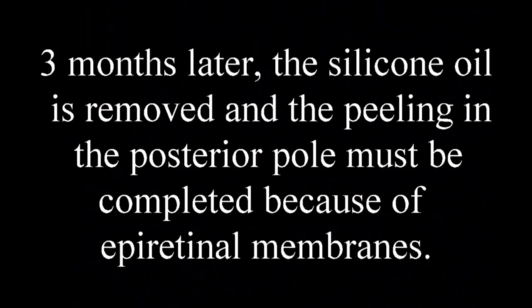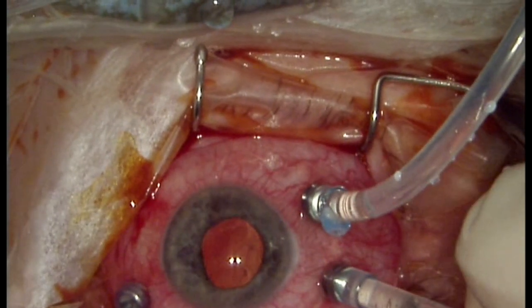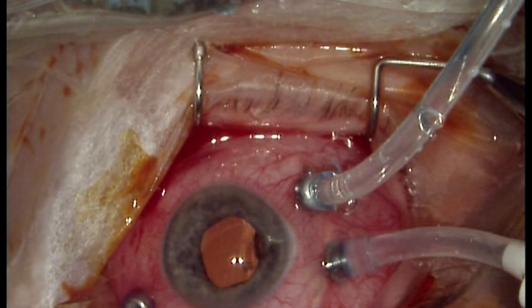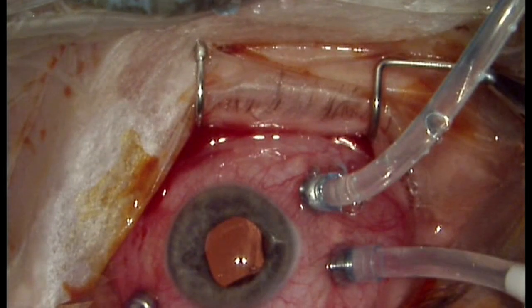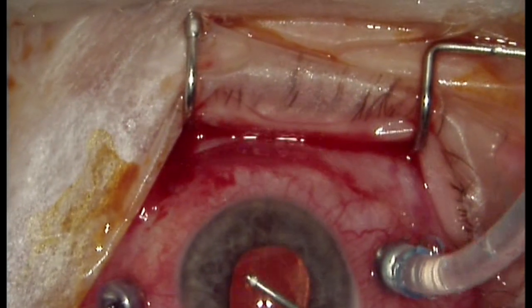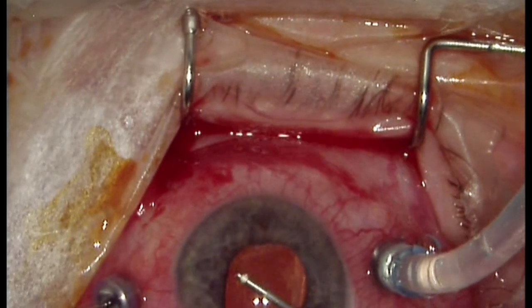Three months later, the silicone oil is removed and the peeling in the posterior pole must be completed because of epiretinal membranes. After silicone oil removal, fluid-air exchange is quickly performed.